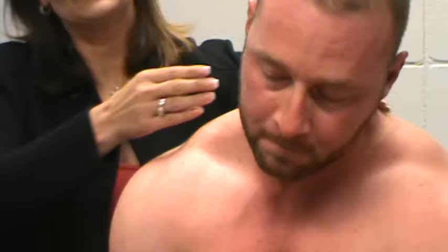Very good. Okay, now I'm going to listen to your thyroid just to make sure that you don't have any bruit. Bruit just means that you have increased blood flow to that area. Could also be indicative of an abnormal thyroid. Okay.